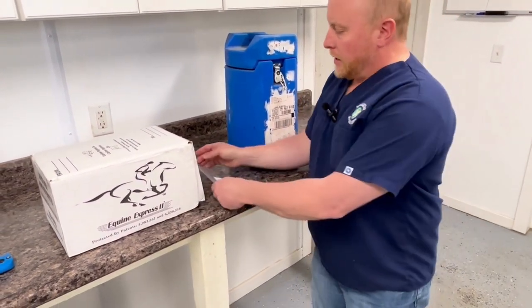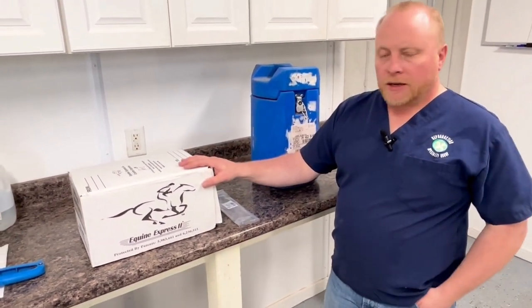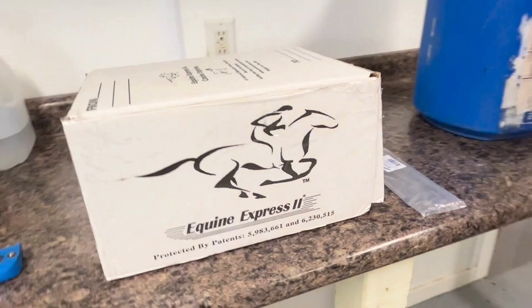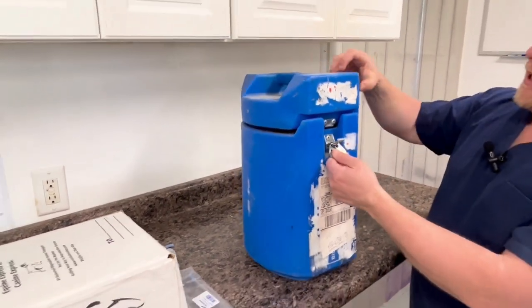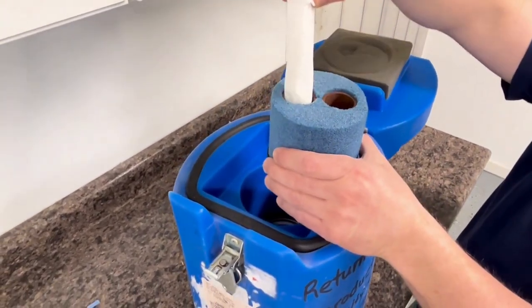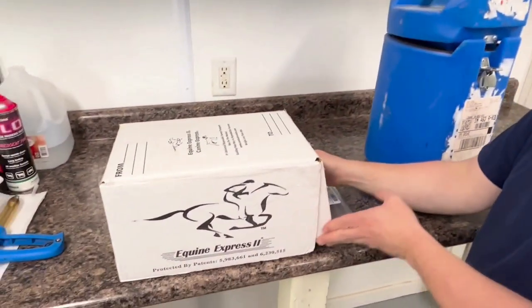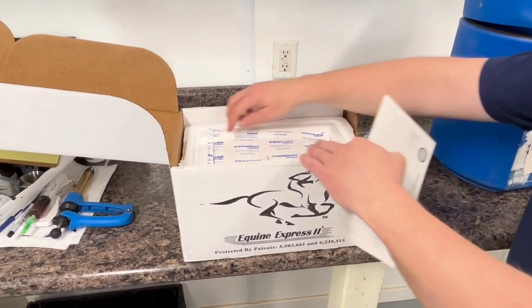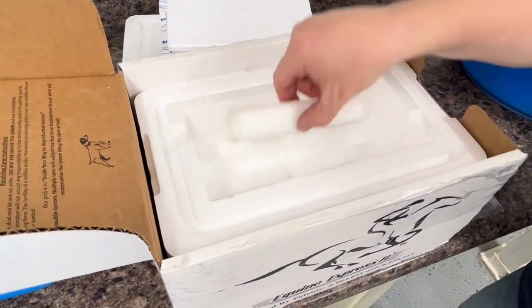When your semen arrives it's going to come in one of various shipping methods. This is an equine express box — or canine express if you look at the other side. This is an equitainer, which many of you have probably already seen and used. The equitainer has ice cans in the bottom underneath the thermal equalizer and the semen sample comes in the top. With the styrofoam box systems, you'll have the lid, an ice pack, and then your sample underneath wrapped up in a towel.